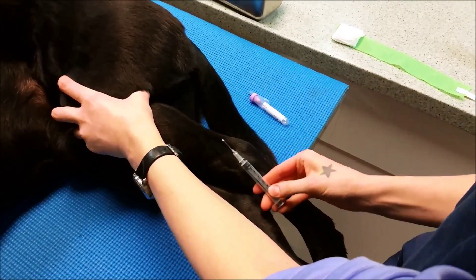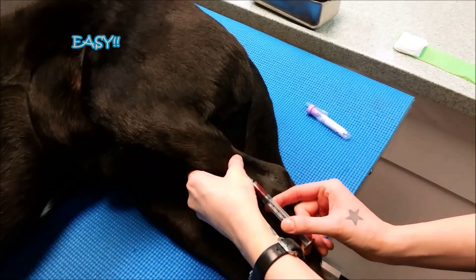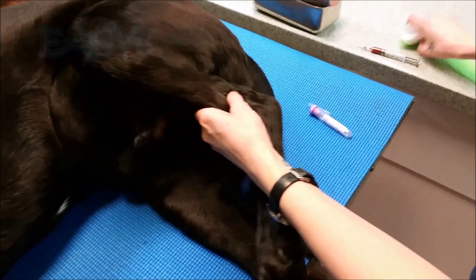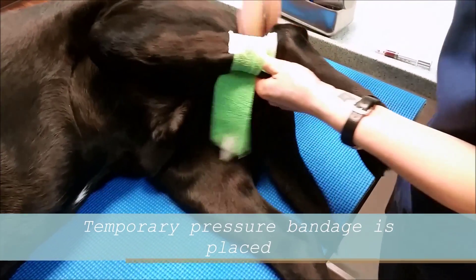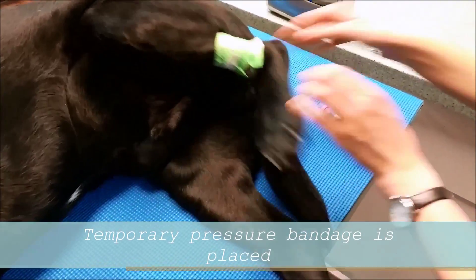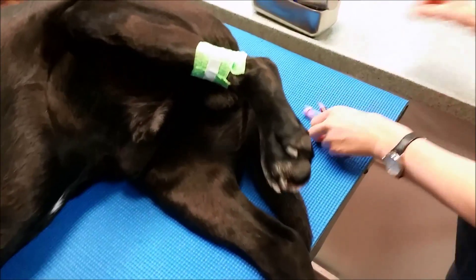All right, I'm just going to enter the vein. All right, so I've got my sample. I'm just going to put a little band-aid here and put some pressure on that so it doesn't bleed.